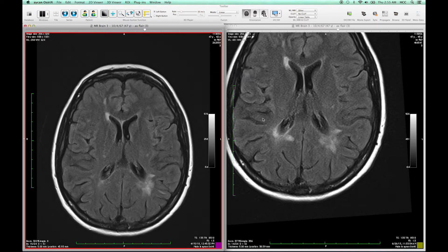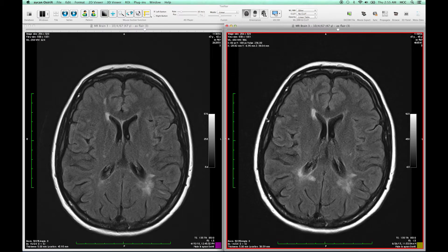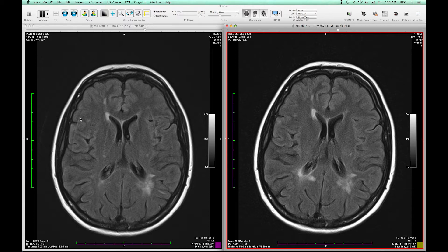So let me just reset those. Although this might work for some cases, in many others the orientation of the slices may differ from each other. For example, if the patient rotates out of the slice between the acquisitions, then it gets even more complicated when we try to add other series for viewing as well. This is where a processing technique called image registration is required, which basically establishes correspondences between image coordinates.